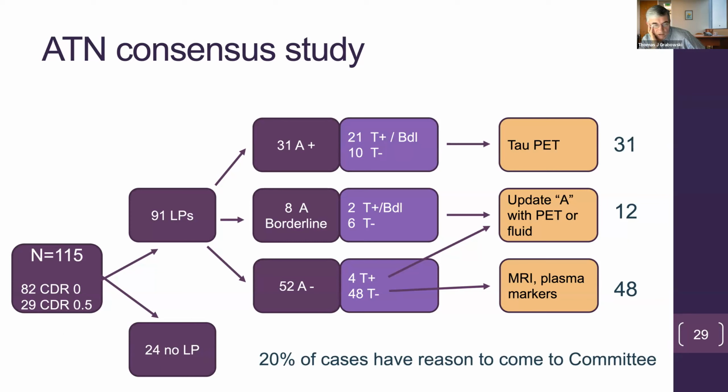biomarkers, and we have evaluated using the biomarkers to triage individuals to those who are amyloid positive and are therefore people we want to look at with tau PET to characterize their anatomical profile of degeneration; those who are amyloid negative, for whom it would not be a good idea to do a tau scan since it's going to be negative and it's just a waste of money, and whom we follow with MRI and plasma markers over time.